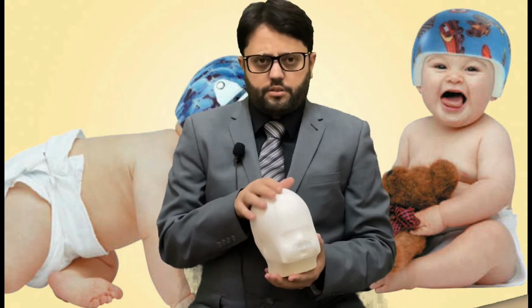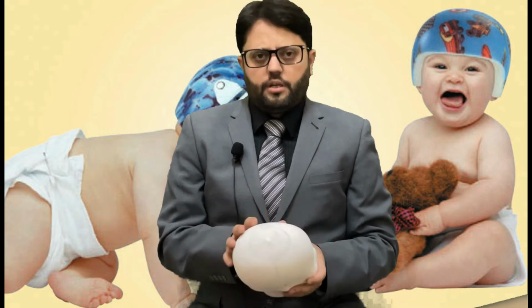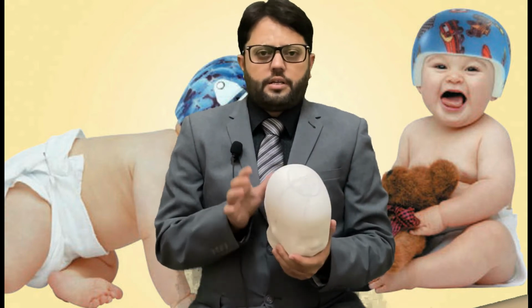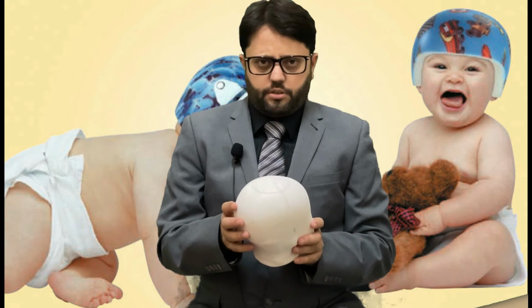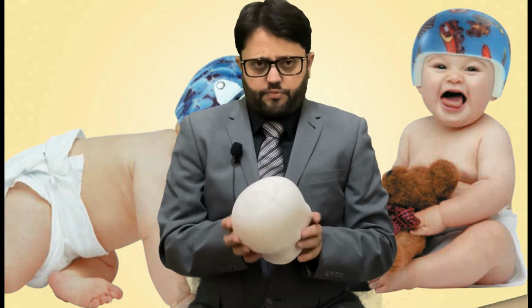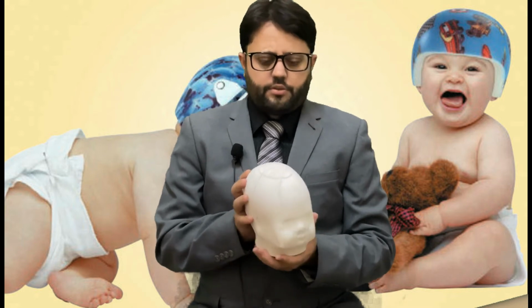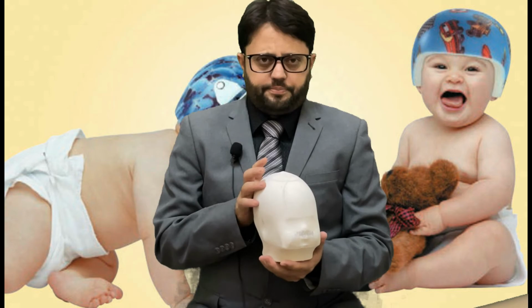He will release the joints, the sutures, and after that we need a cranial remolding orthosis to shape the head accordingly as per the requirement. In those cases we have to use the helmet as a protective and as a corrective measure.